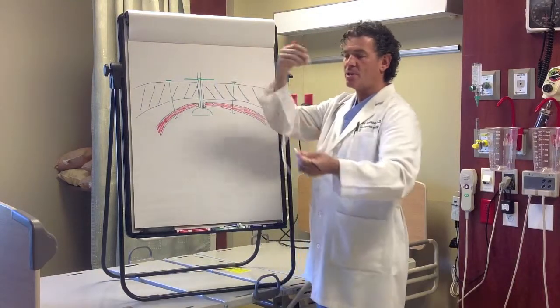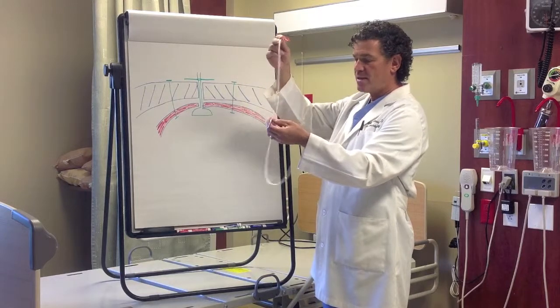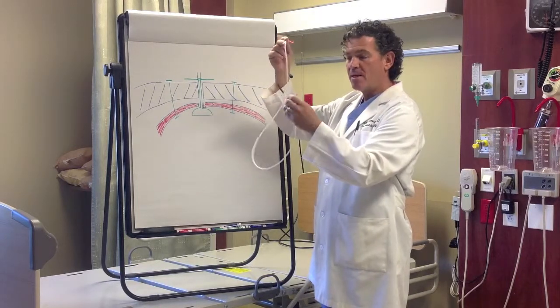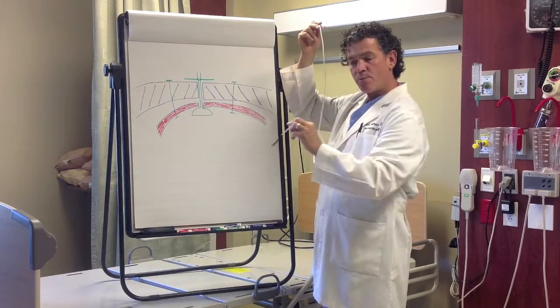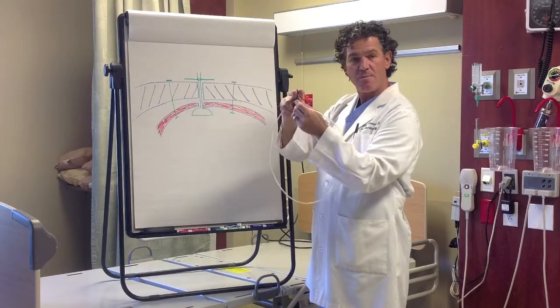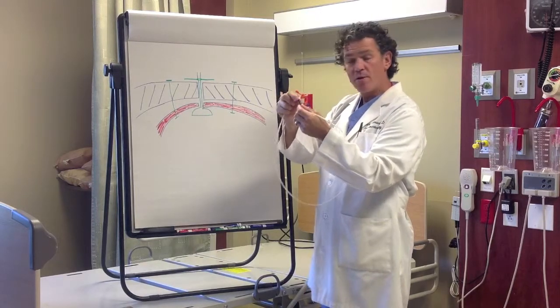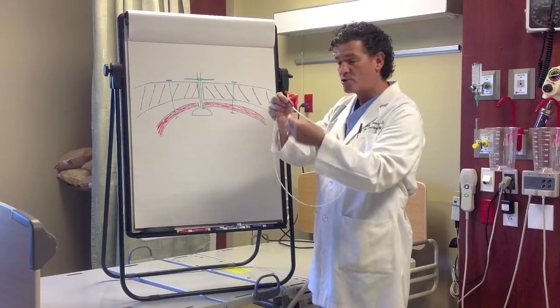It's very flexible, it's a comfortable tube, it's small diameter, and the reason that it's designed not only for comfort, but it allows the body's peristalsis, the intestinal peristalsis, to push this tube further down the GI tract. And that's one of the purposes of the metal at the end, the weights. The other thing is that you can see it on x-ray. That's the other purpose of this, so you can see where the tube is.